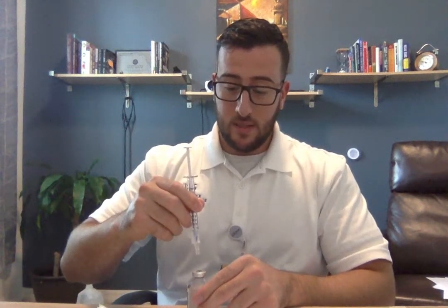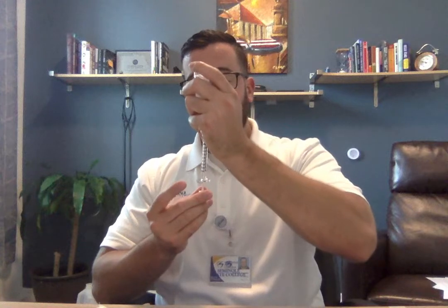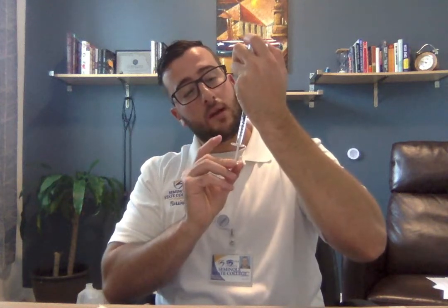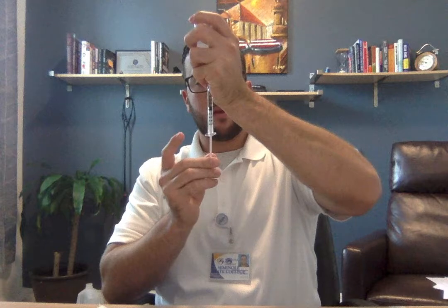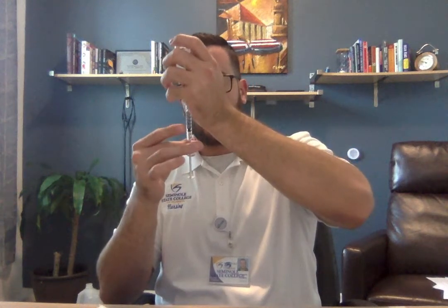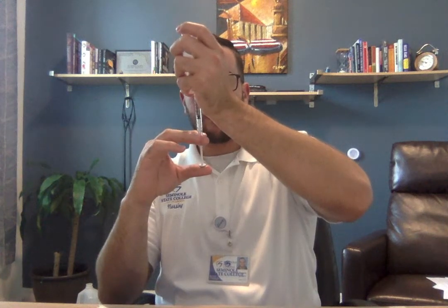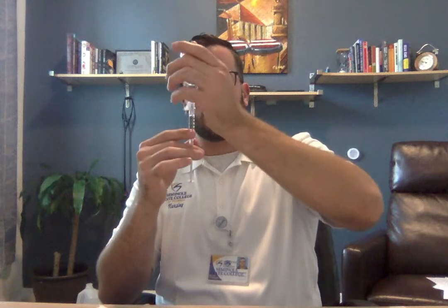So 0.5 ml, I'm going to get my vial, take out my alcohol pad so it's clean, place this on top. I'm going to bring down the plunger, putting air into the vial, and then I want to go ahead and take out 0.5 ml. Once again, being sure not to contaminate the inside of the plunger. I'm going to flick it, make sure I get all the bubbles out. I don't see any bubbles or anything. I'm going to bring this up a little bit higher. Okay, so I got the amount that I need.